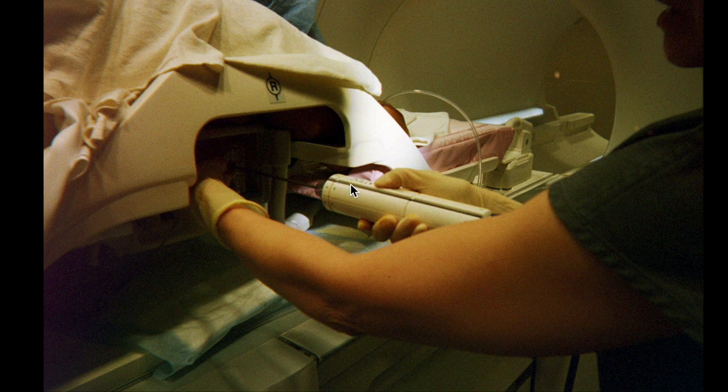If I wanted to take samples at 12 o'clock, I just hold that flat piece there, or I can go around to a 2 o'clock position. I usually take 6 samples at 12, 2, 4, 6, 8, 10.